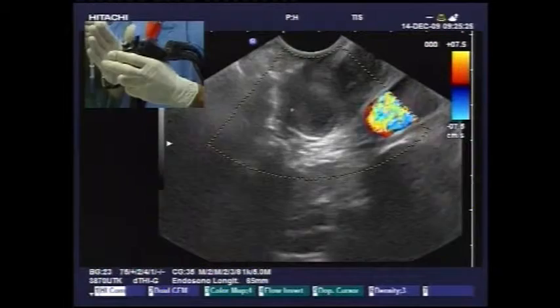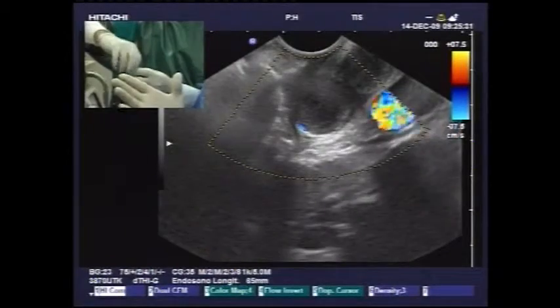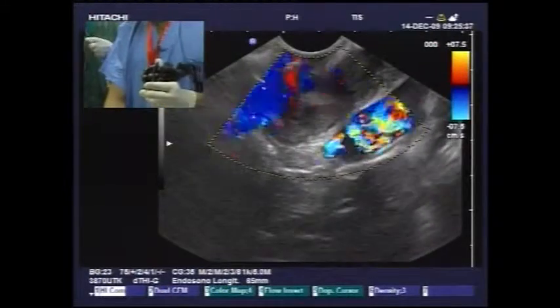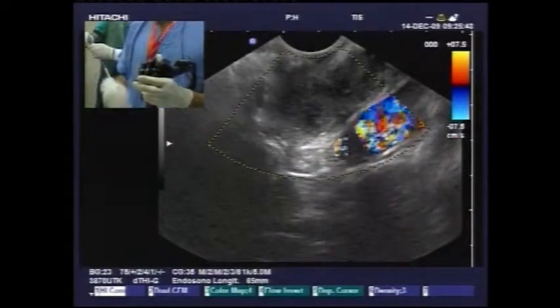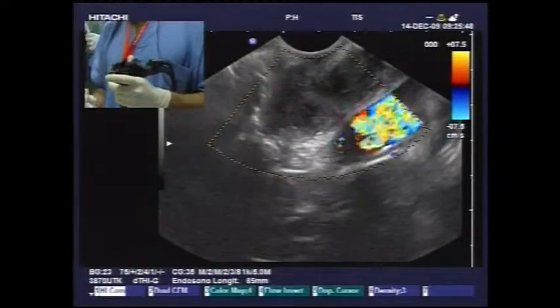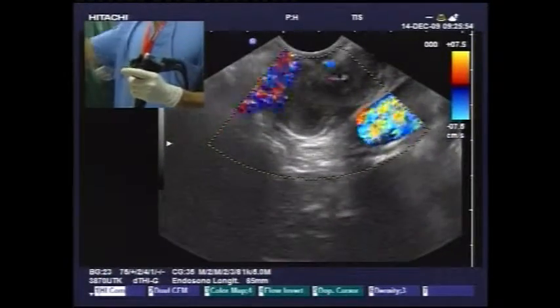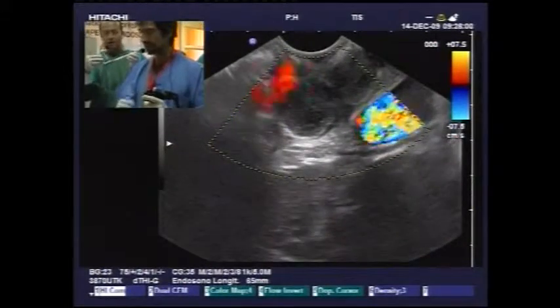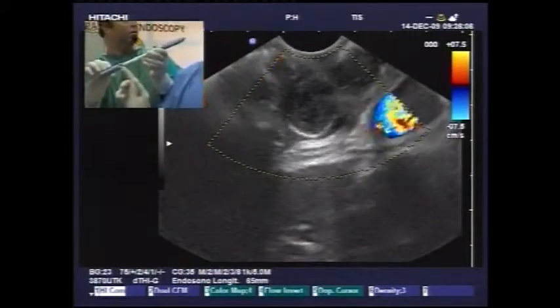What we do in our department is usually to remove the stylet, because the stiffer part of the needle is the stylet. So we remove the stylet. Talking to our pathologist in this case, he or she has to know that we are passing by the gut wall, so sometimes it could have gut cells inside the specimen. So I can put the needle in, and you see here that the outer sheath is on the 0 position. In this case, I can go clearly without harming. You see it is at 0.